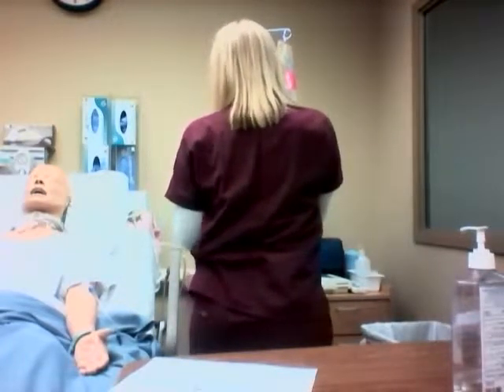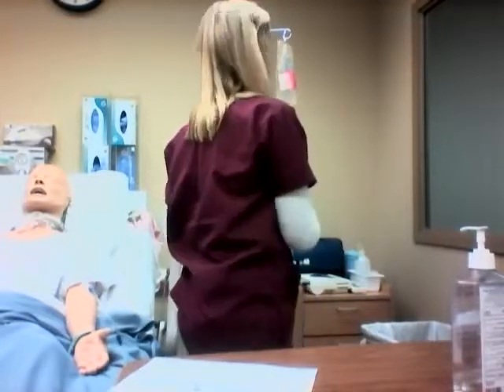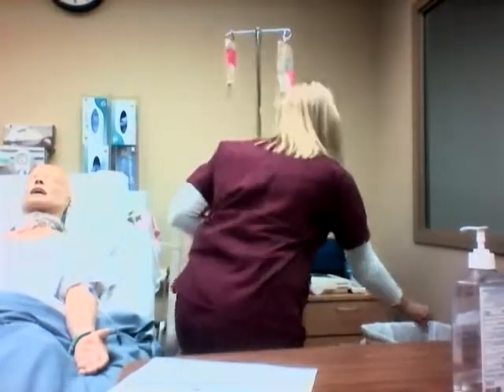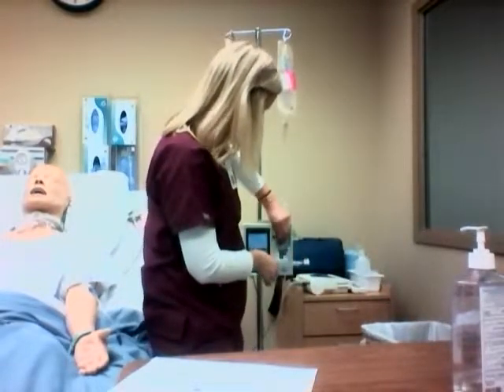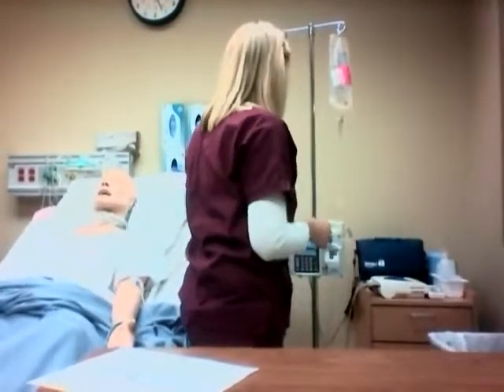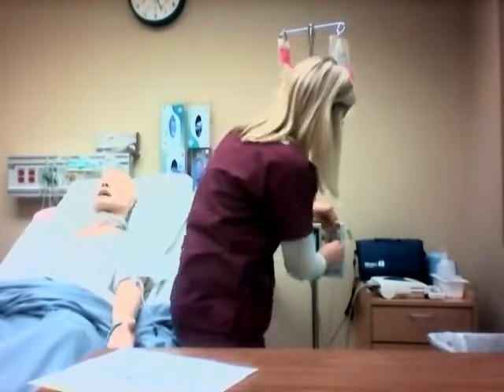Okay, so I've got my tube clamped here, and I'm going to clean my hub. So I'm going to clean my hub here for at least 15 seconds. And now I am going to connect this without contaminating.